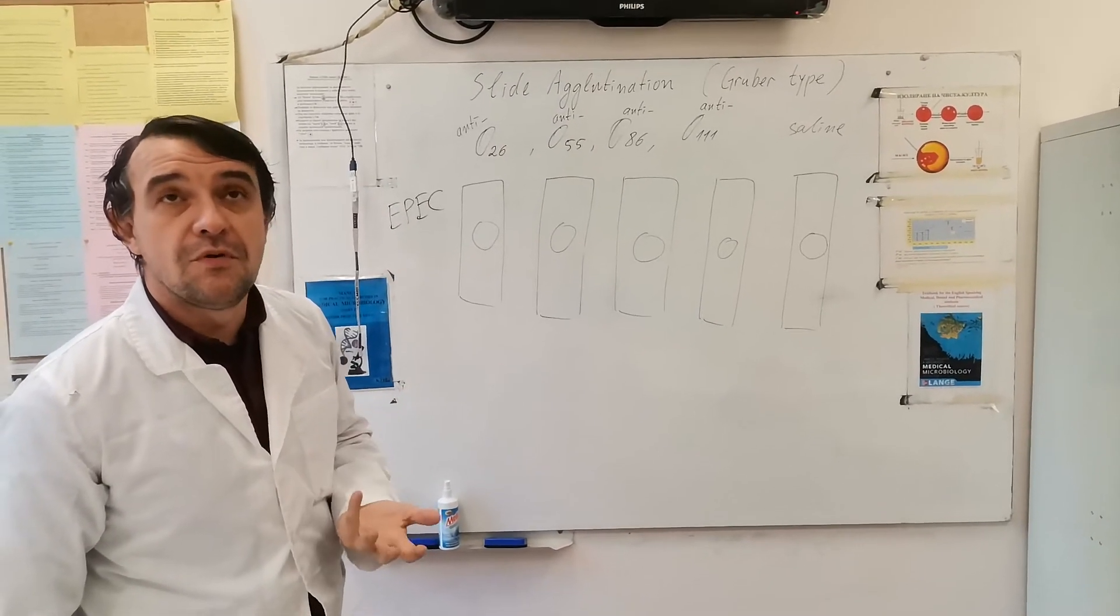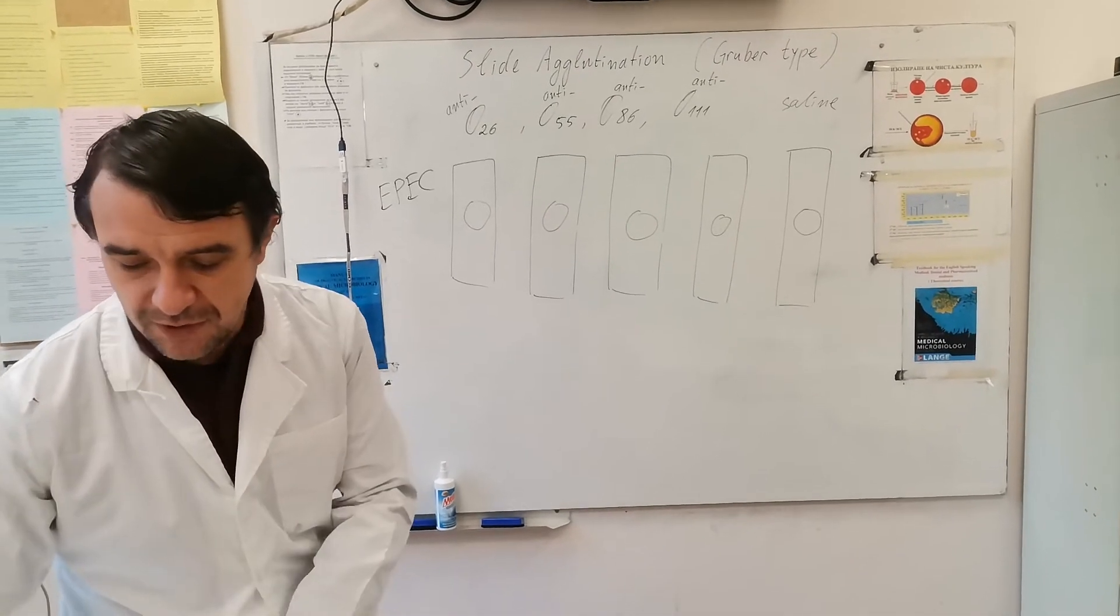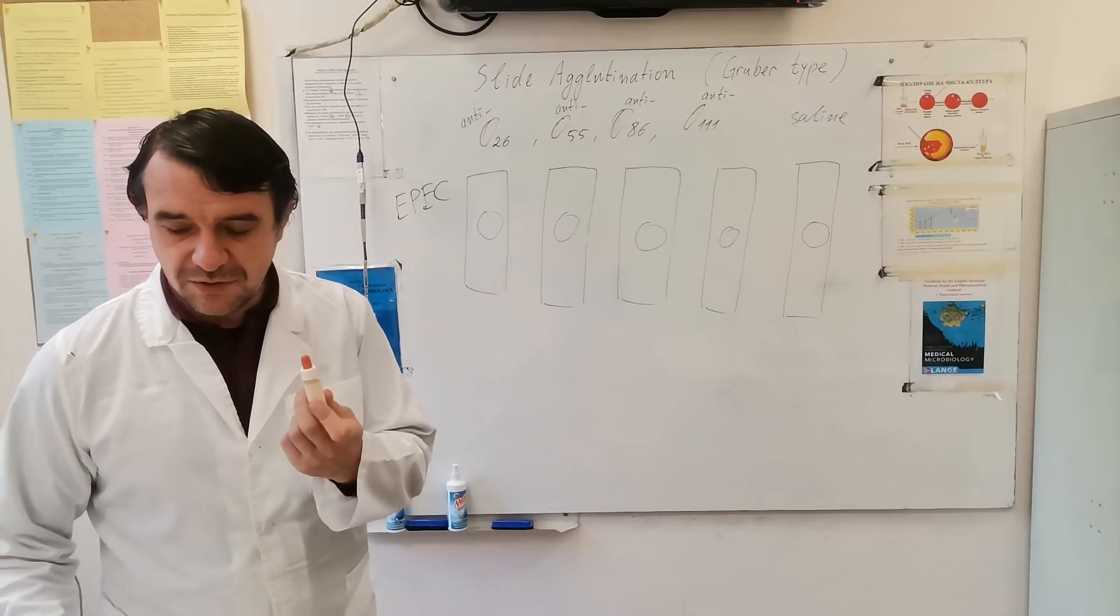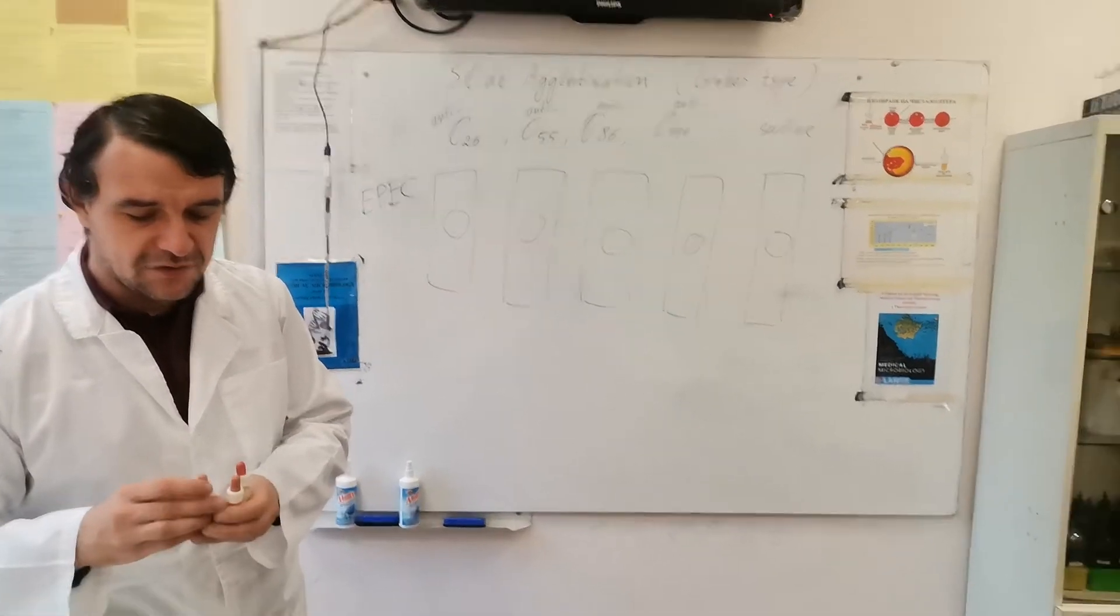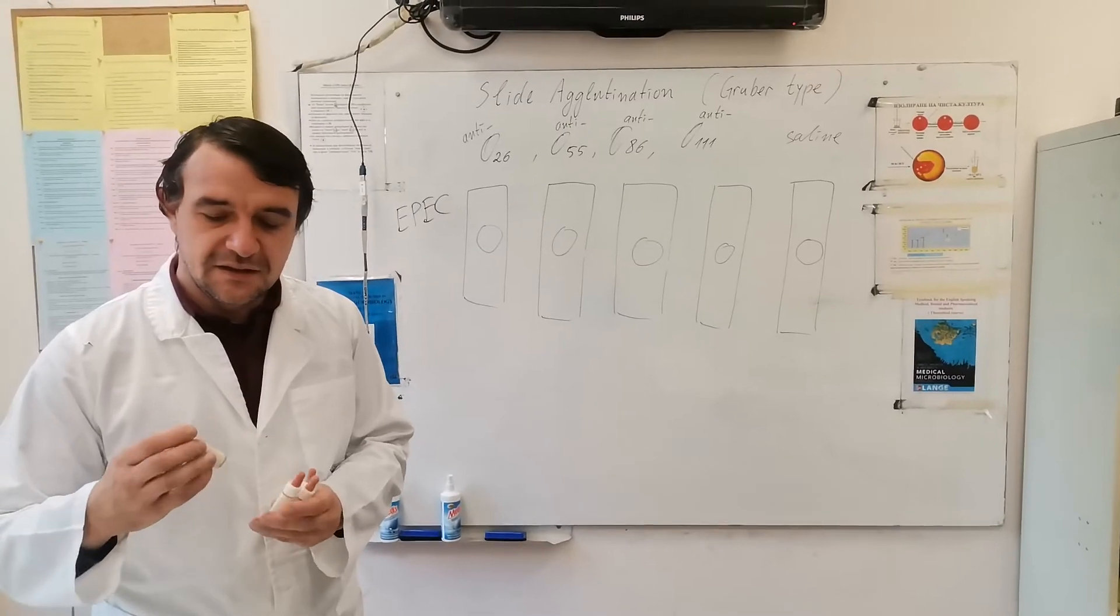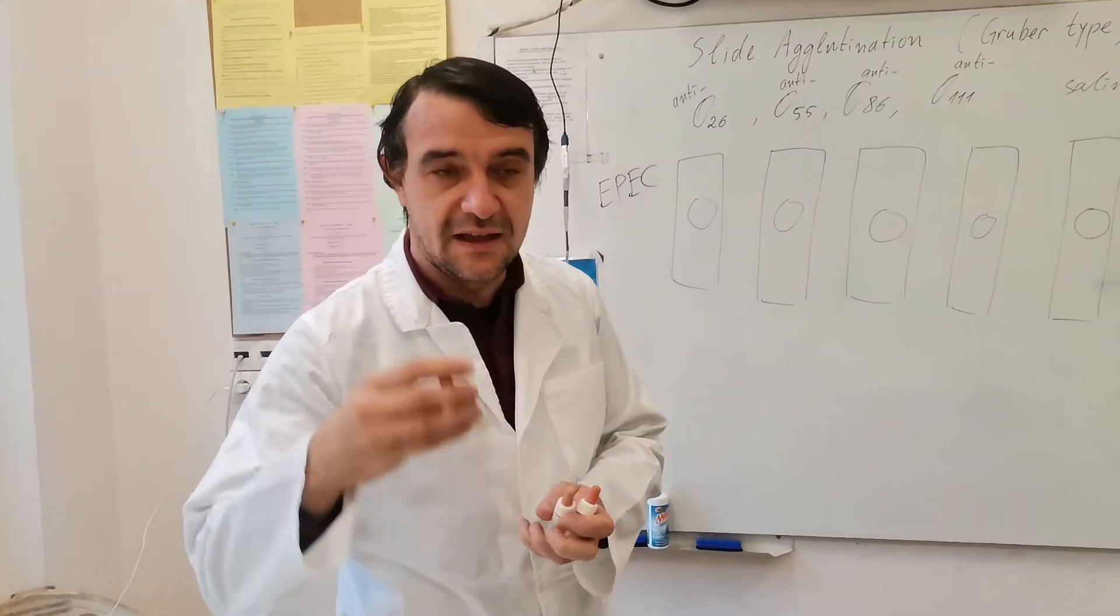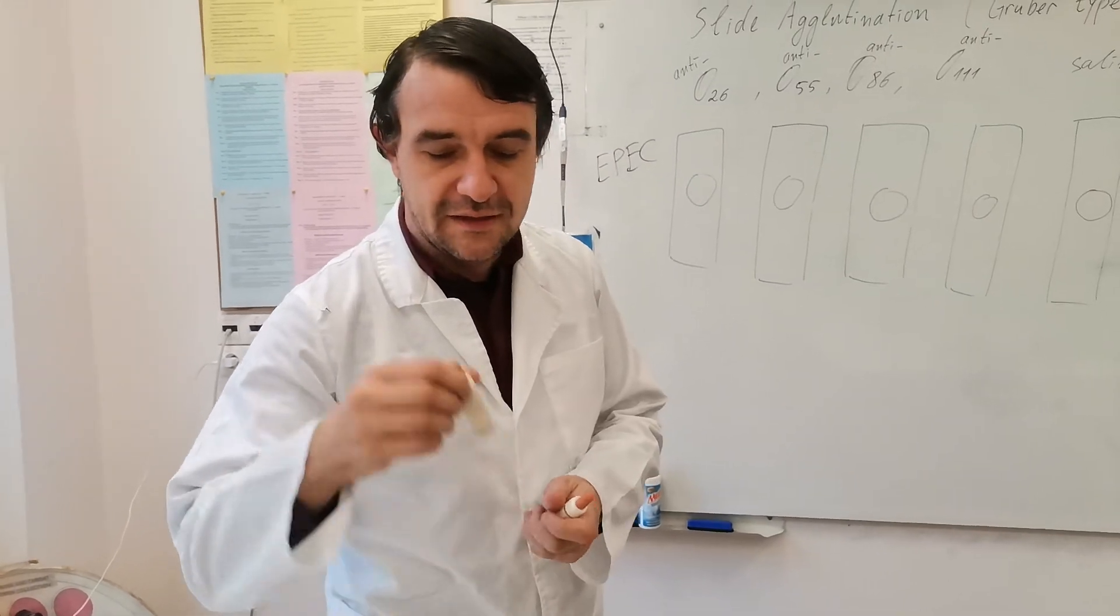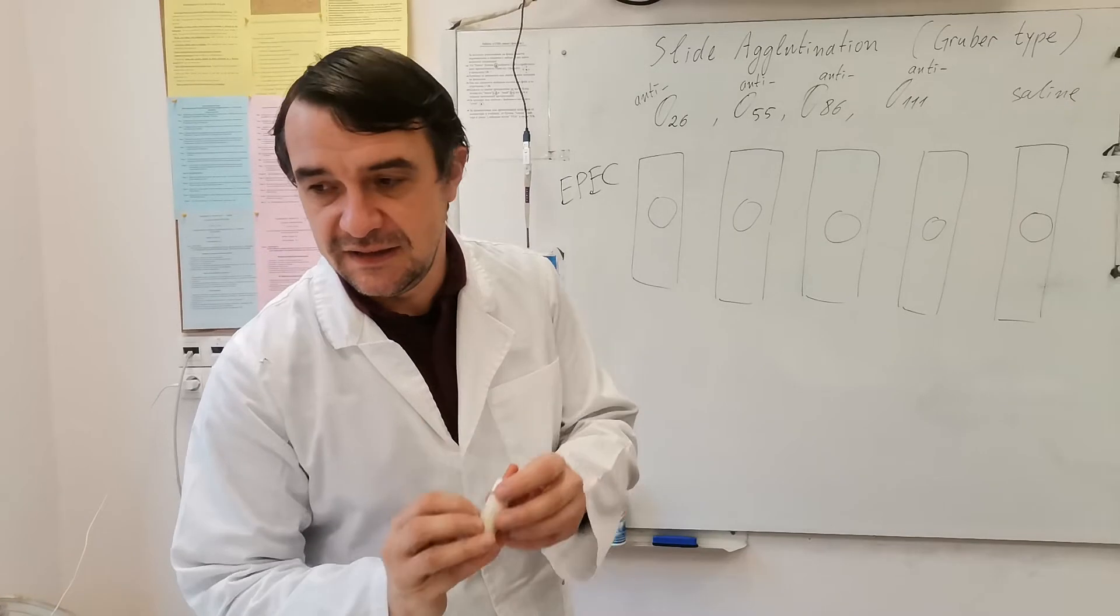In order to prove the presence of an antigen, we need to use specific antibodies. In these small vials, there are antibodies against those enteropathogenic serotypes. These are anti-O26 antibodies, anti-O55, anti-O86, and anti-O111.